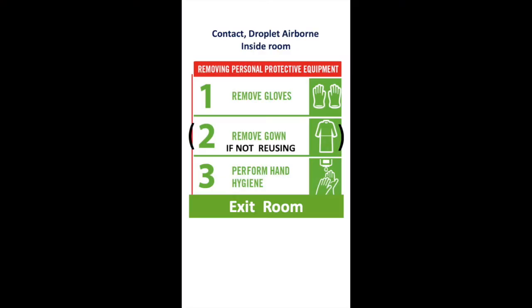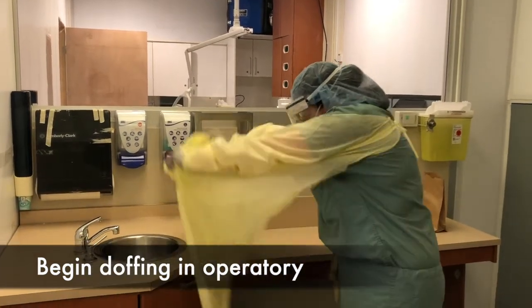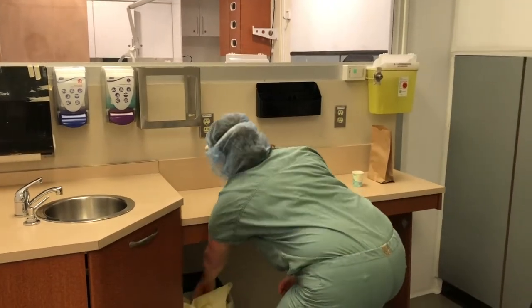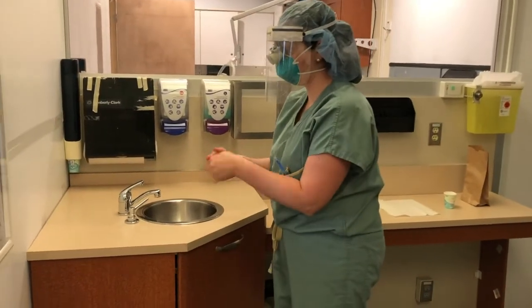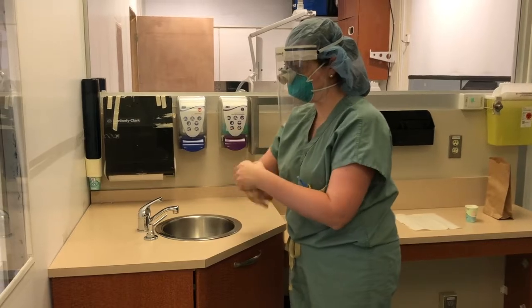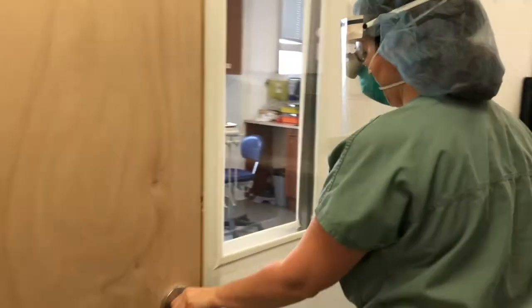For your reference, there is a sign indicating the doffing sequence inside the treatment room. Remove your gloves and gown inside the operatory. Use hand sanitizer and exit the room, closing the door behind you.